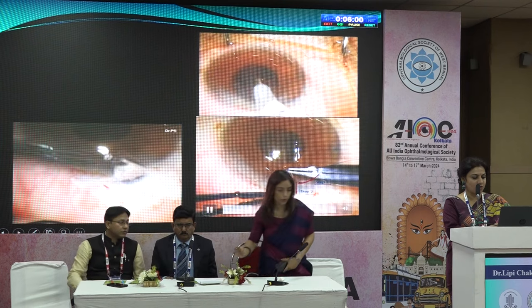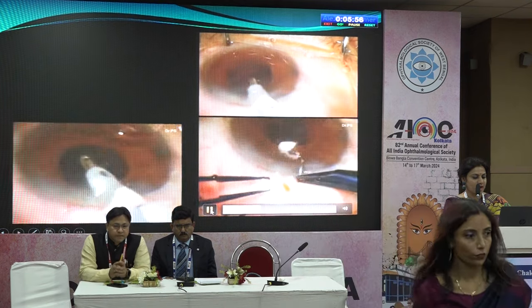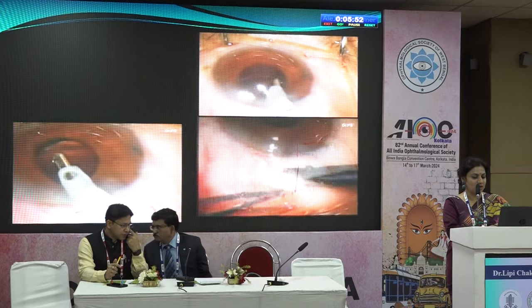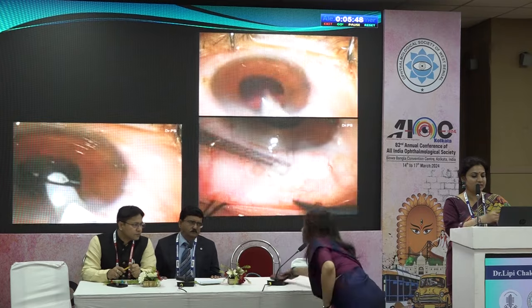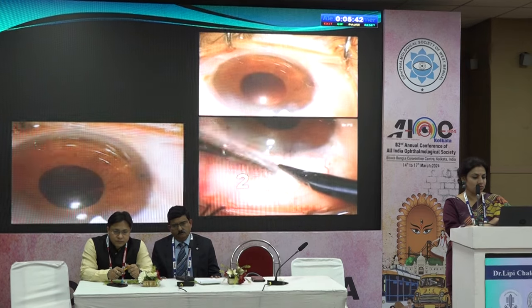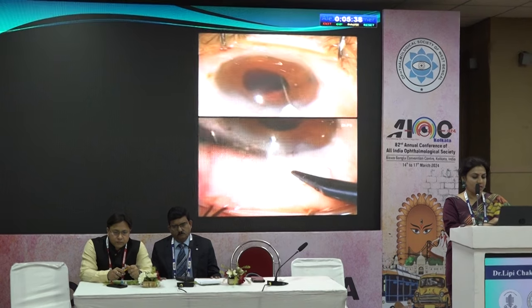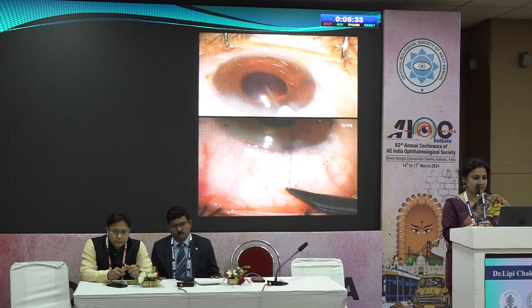This is step one, cornea to cornea. Step two is from cornea to the scleral flap. And step three will be from the flap to the sclera. So these are the three steps. And after doing this, we need to tie the four knots, circle it four times. So this is one, two, three, and then four. Yeah, and we do not need to lock it here. We just need to leave it as such.